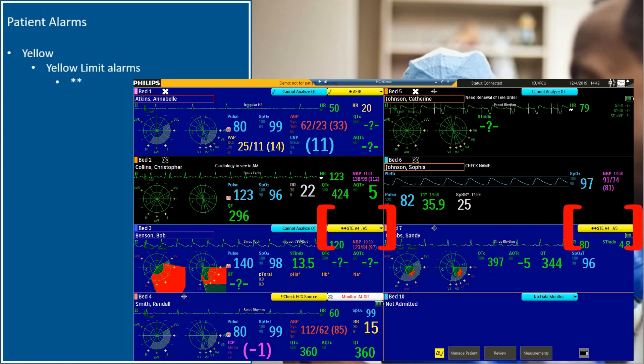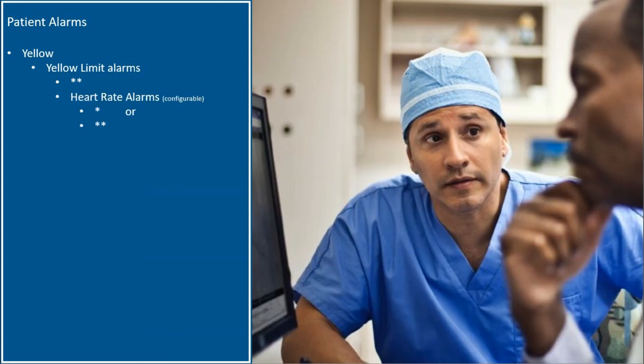Yellow limit alarms will display with two stars. Note that based on configuration, your heart rate alarms may be configured as one or two star alarms.